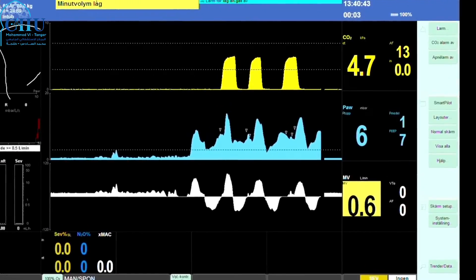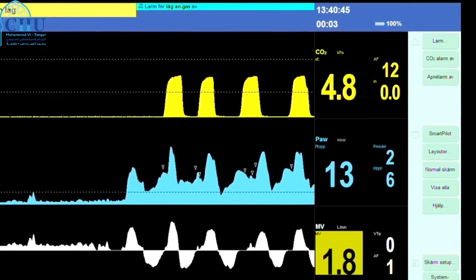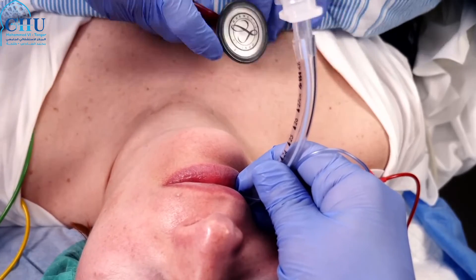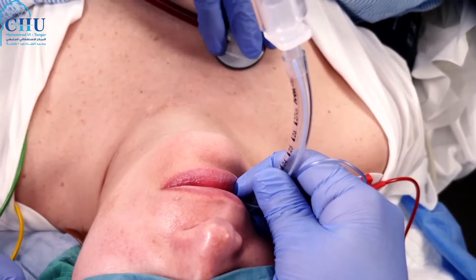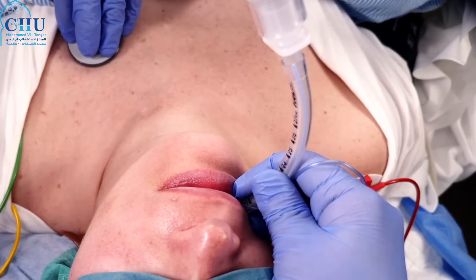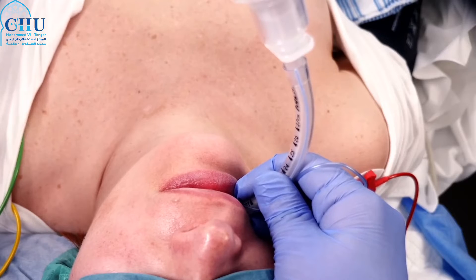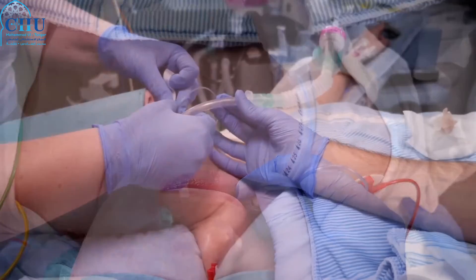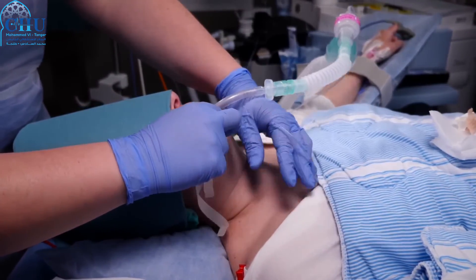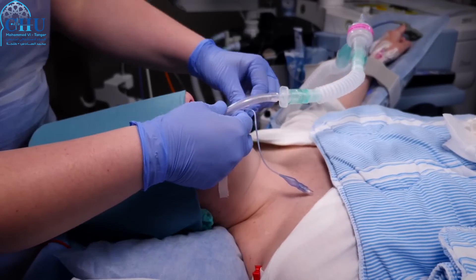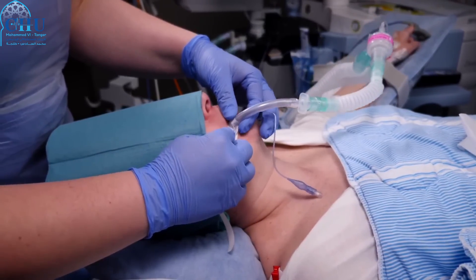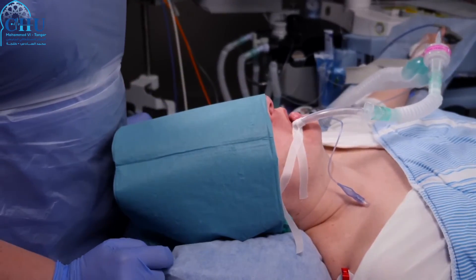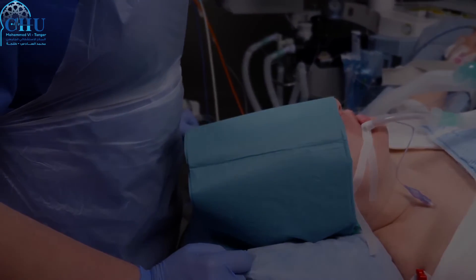The gold standard is return of end-tidal carbon dioxide over several respiratory cycles. Be very cautious when interpreting other signs traditionally used — auscultation findings on both lungs, condensation in the tube, and symmetric rise of the chest wall — as these may very well be positive despite an esophageal intubation. When you're absolutely certain that the tube is in the trachea, secure it with tape and initiate mechanical ventilation. Congratulations, you have now performed an endotracheal intubation. For more videos on anaesthesia and critical care, go to interannas.blogspot.com.